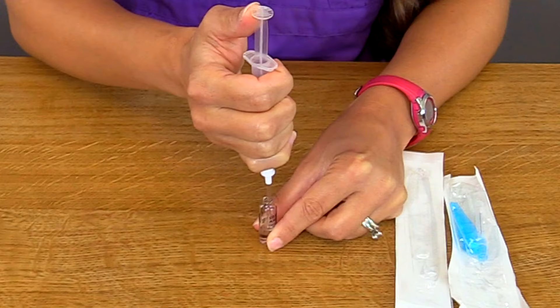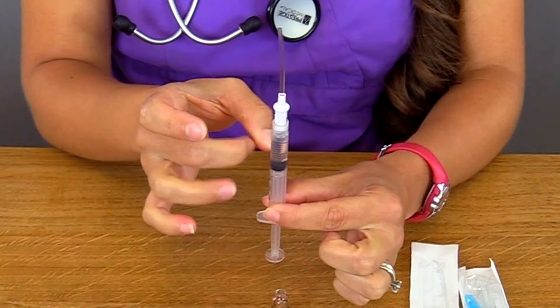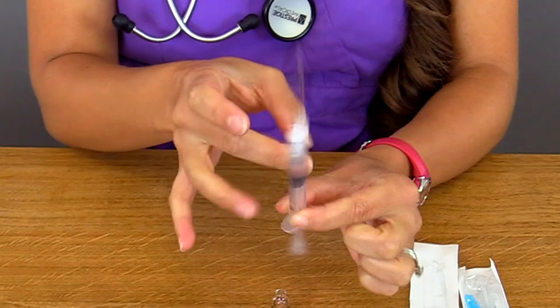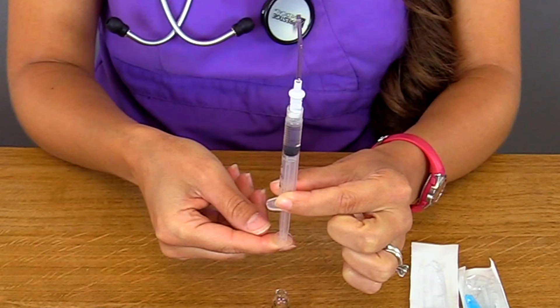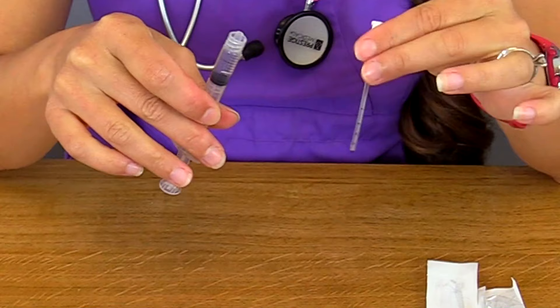Then remove the filter straw, turn the syringe upright, and slightly flick it to get the air bubbles out — you want to get them all out; they can be stubborn sometimes. Then push up slightly on your plunger — a little bit of medication can sometimes drip out, and that's okay. Push out to the prescribed amount. Then remove the filter straw and dispose of both the filter straw and the glass ampule into the sharps container.